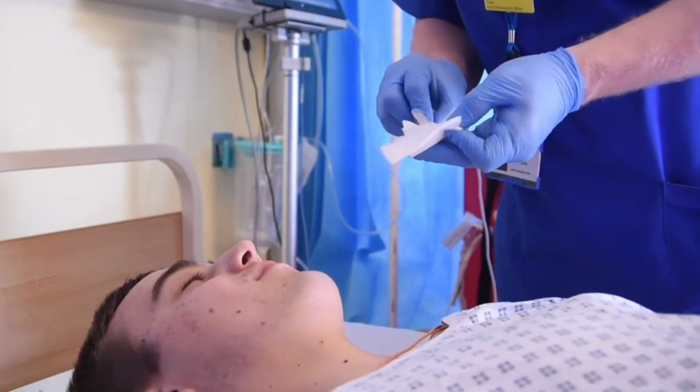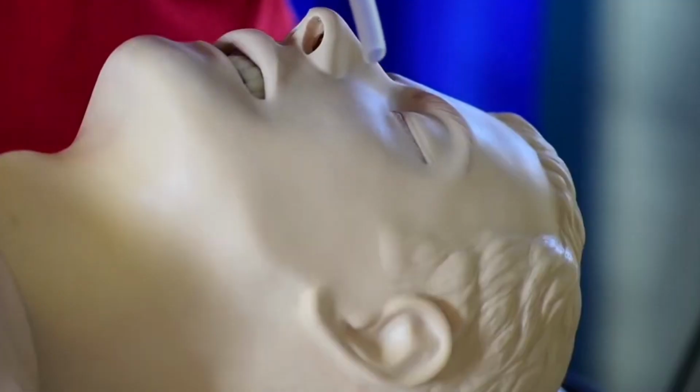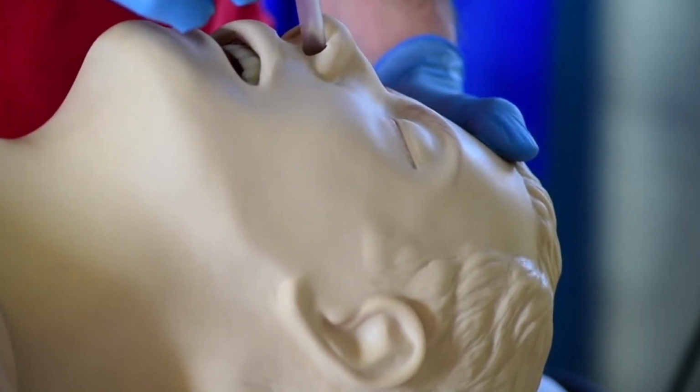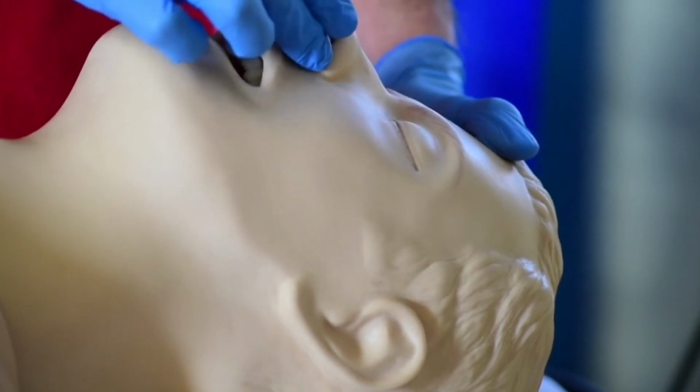The NPA is lubricated, taking care not to occlude the lumen with a plug of lubrication gel, and carefully inserted from the nasal opening up into the nostril. When a sufficient length has been passed to have cleared the nostril, the airway is then inserted vertically back into the nasopharynx.